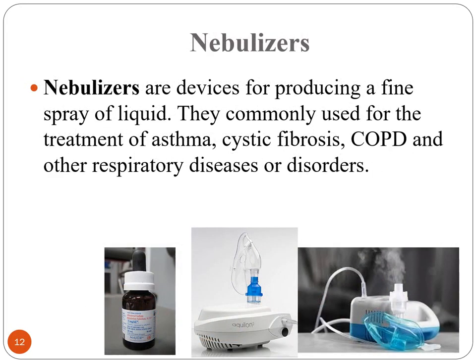We have the nebulizer. Nebulizers are devices for producing a fine spray of liquid. They are commonly used for treatment of asthma, cystic fibrosis, chronic obstructive pulmonary disease, and other respiratory diseases or disorders. This is a nebulizer.